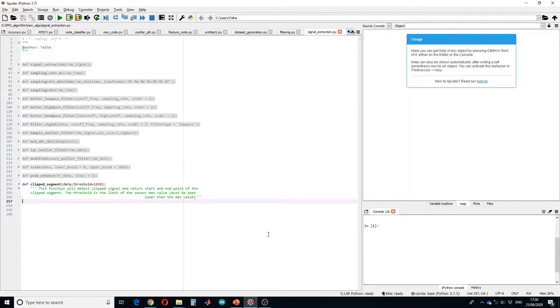In this tutorial, I will show you how to design a function that can detect a clipped signal and return the start and end points of the clipped segment. First, we need to detect if there is any clipping in our signal. To do so, we will apply a threshold and save the points which are above the given threshold. The value of this threshold will be given by the user and is considered to be the sensor maximum value.